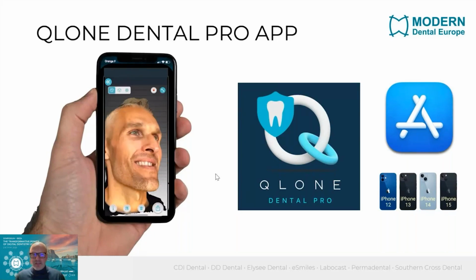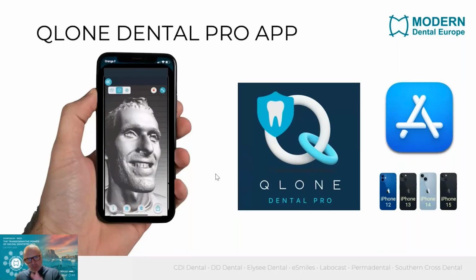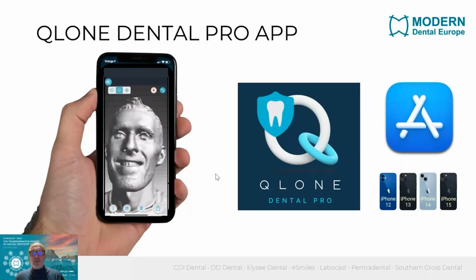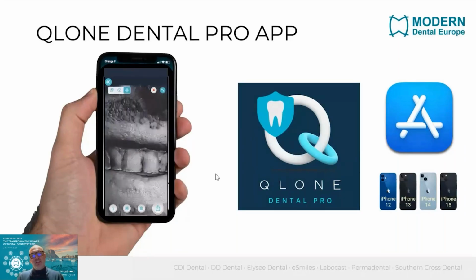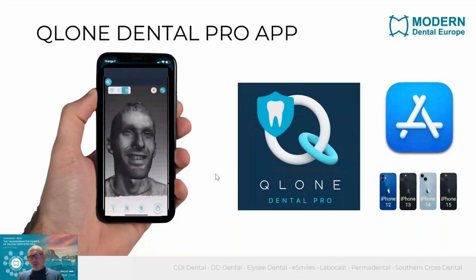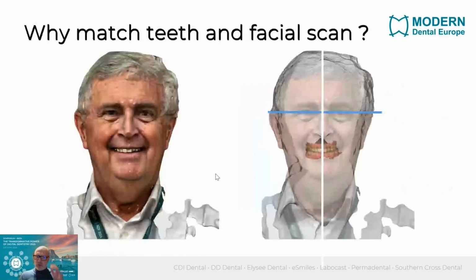It's very easy. It's only 20-30 seconds of scanning around the face, and then you zoom in on the oral zone, and you see that the mesh is actually quite detailed here. It's very comparable to Rayface, which is amazing, and they did an amazing job here in quality, if you see these results.